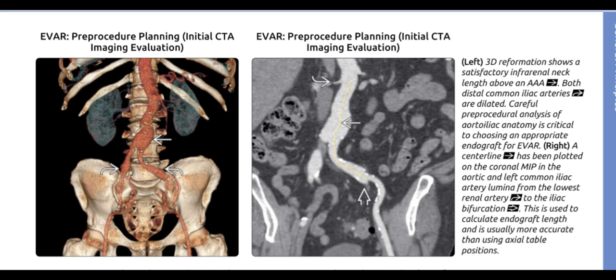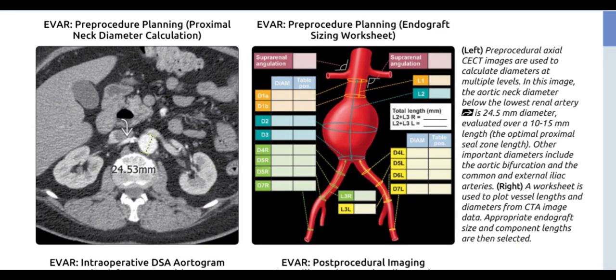3D reformation shows a satisfactory infrarenal neck length above a triple-A; both distal common iliac arteries are dilated. Careful pre-procedural analysis of aortoiliac anatomy is critical to choosing an appropriate endograft for EVAR. A centerline has been plotted on the coronal MIP in the aortic and left common iliac artery lumina from the lowest renal artery to the iliac bifurcation, used to calculate endograft length and usually more accurate than axial table positions. Pre-procedural axial CECT images calculate the aortic neck diameter below the lowest renal artery at 24.5 mm, evaluated over a 10–15 mm length.